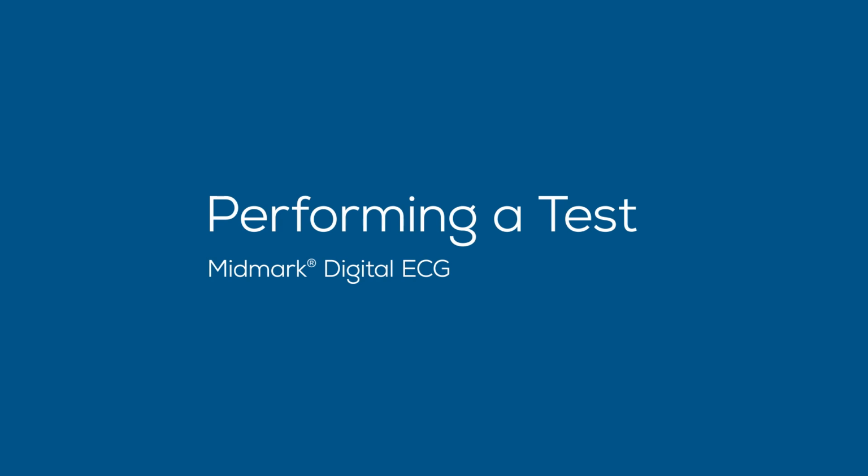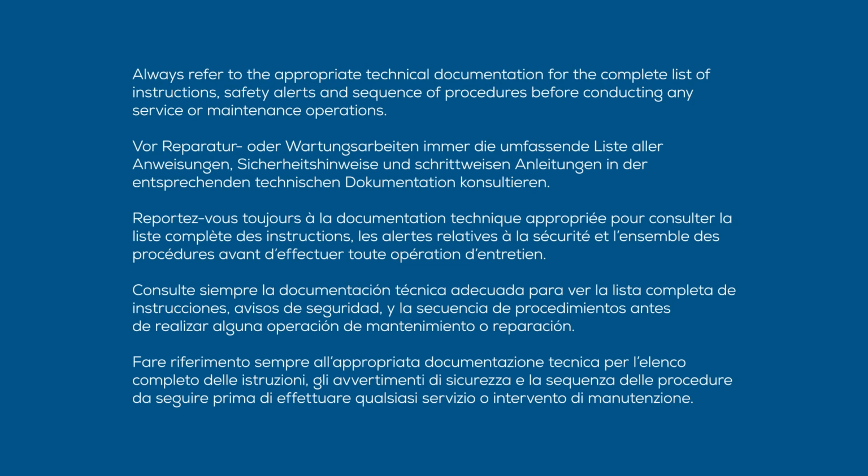This video is an overview of performing a test using the Midmark digital ECG. Always refer to the appropriate technical documentation for the complete list of instructions, safety alerts, and sequence of procedures before conducting any service or maintenance operations.